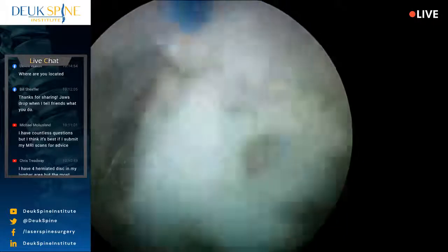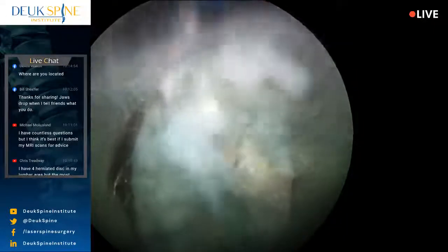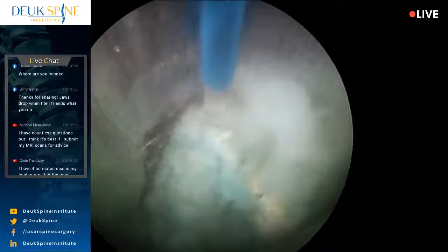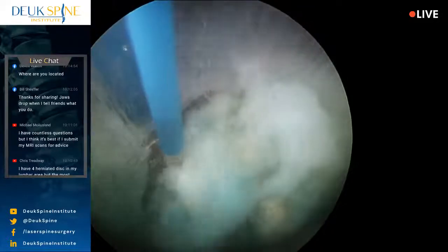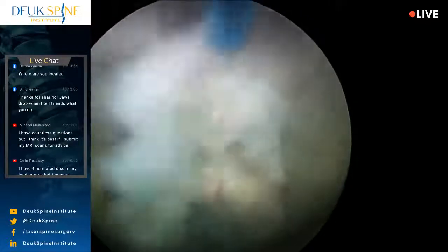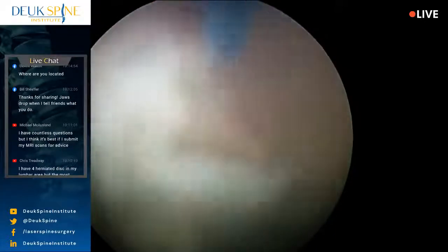But what I'm here to do is repair this tear. Look how bad it is. All this blue stuff coming out is herniated disc stuck inside the tear. And I have a name for it. It's called interposed herniation. And interposed herniation, which is the nucleus material stuck in the annular tear, is the cause of the inflammation. It is the source of inflammation. It is the bad entity that we're here to remove.